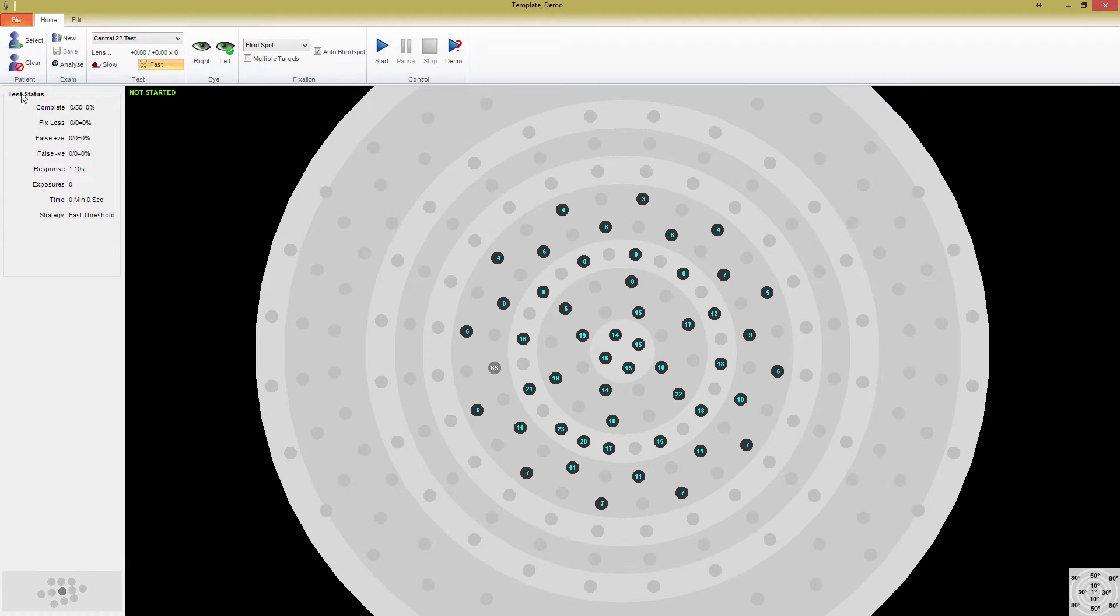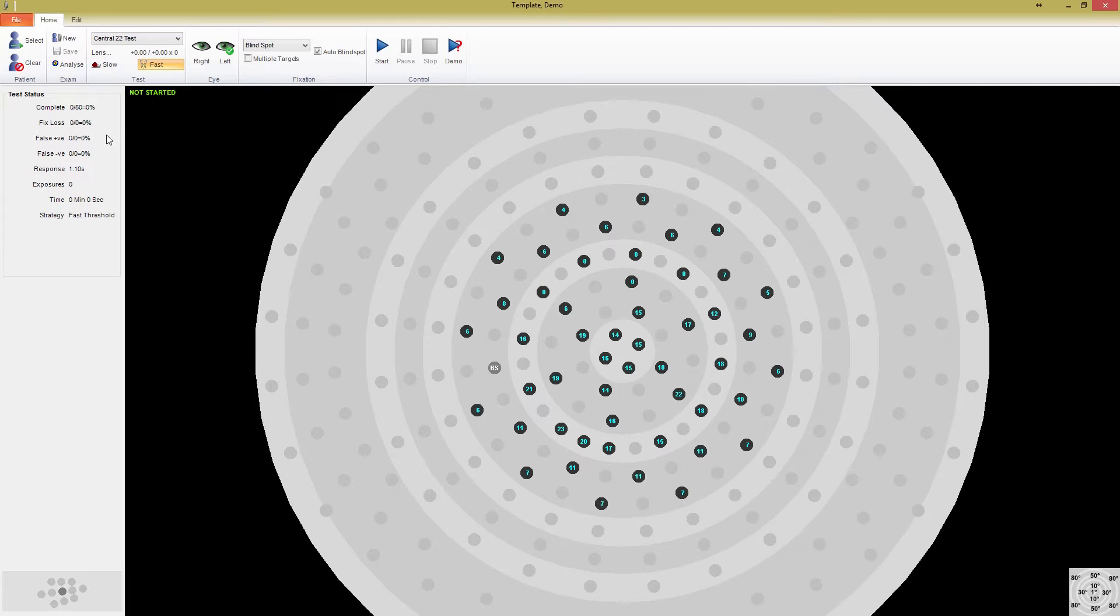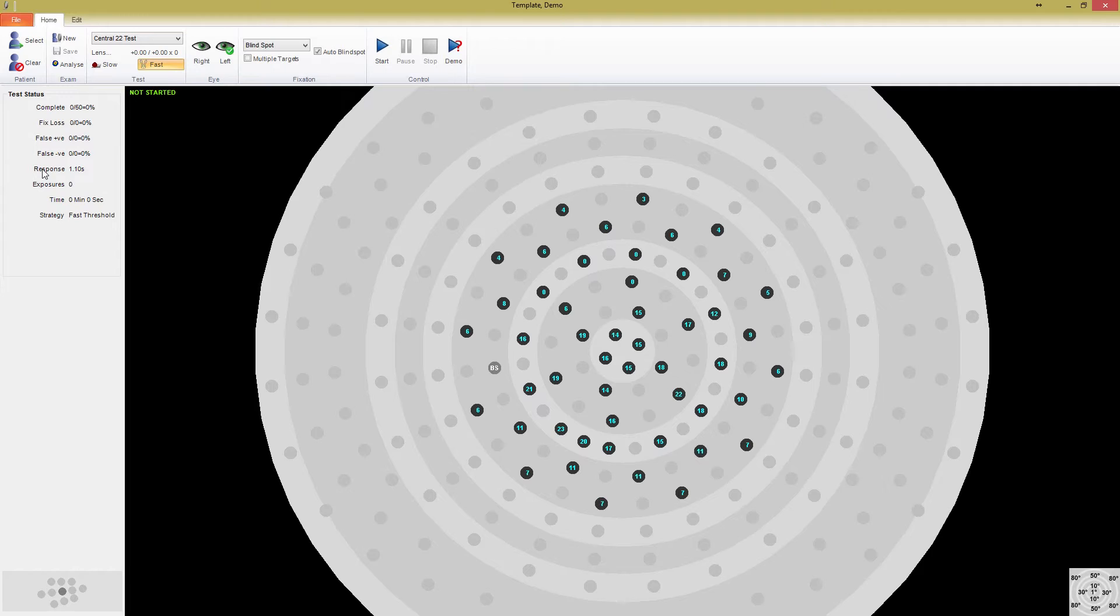The complete monitor shows the number of stimulus points that have fully completed. The fixation loss monitor shows the number of times that fixation has been lost as a percentage of the amount of times it has been checked. With blind spot monitoring, this is a function of the number of times the blind spot has been exposed, which occurs at about every 10 exposures. Video fixation monitoring continuously updates throughout the test. False positive and false negatives are important in determining the reliability of the patient you are testing. A false positive occurs when a patient indicates they've seen a point that was not displayed. This often occurs when the patient is simply responding to the rhythm, or they're trigger happy. High rates of false positives may indicate your patients need more training and some extra practice.